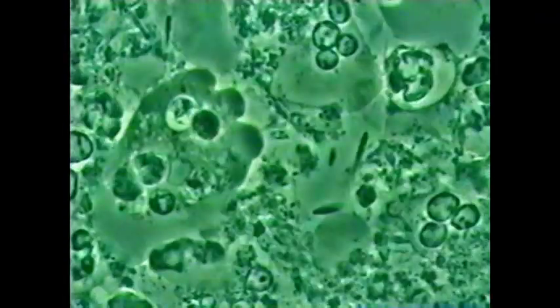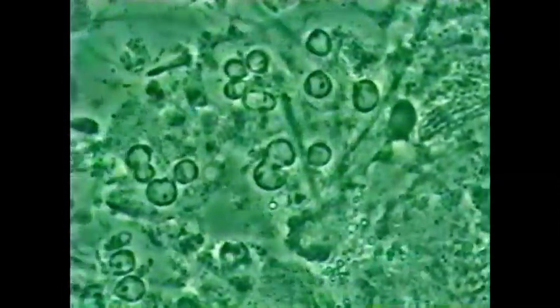Here again, always the same, pretty much infection, amoeba, white cells, the bacilli very present, red complex, and parasites are omnipresent. So let's use the microscope to do our diagnostic. Let's use the microscope to do normal treatment, get rid of those parasites, get rid of those bacilli, spirochetes, and get rid of this inflammation. When all this is gone, you have green complex only, cocci and filaments, and then your patient can be cured.